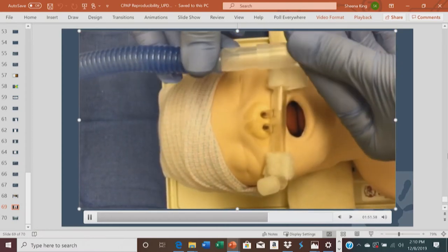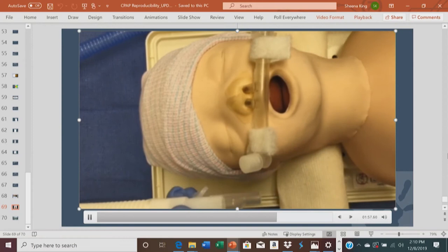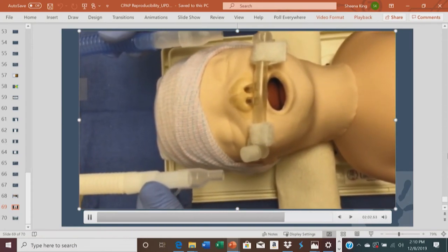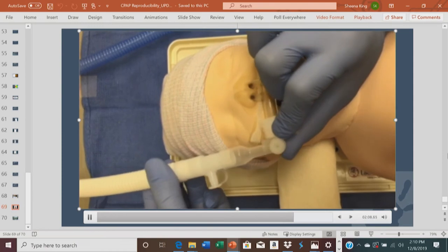Have two pieces of tape prepared to secure the tubing to the hat. Ensure each tube has a connector. The wider part of the connector should be facing away from the baby. On the white tube, the wider part should be positioned parallel to the valve and away from the baby's face.